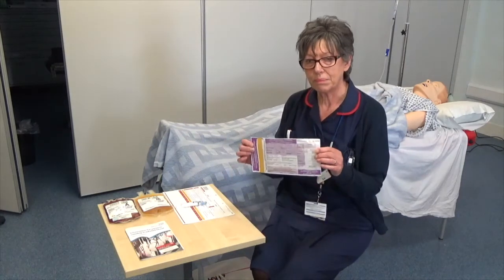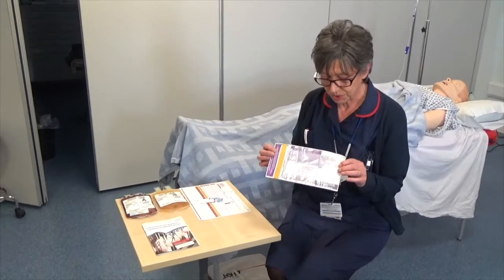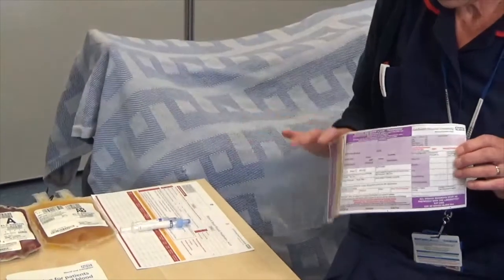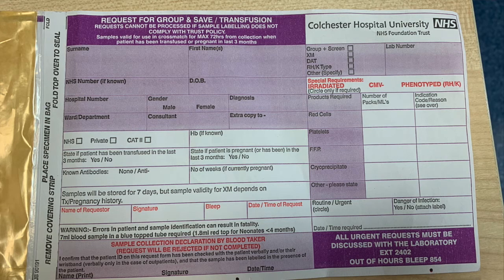This is the blood transfusion group and screen form. Very self-explanatory, but if you do something wrong on it, it will be rejected by the laboratory. So please make sure that you take great care in what you're doing. Patient identification is an absolute must. All the patient details at the top. You can put a patient identification sticker on here, but please make sure it's the right patient's ID.